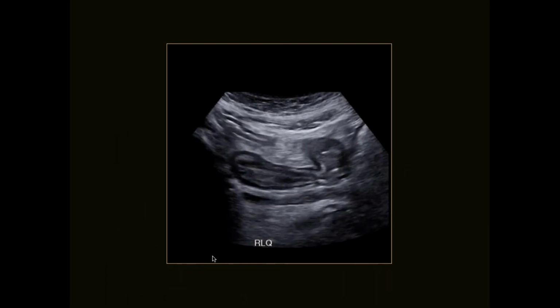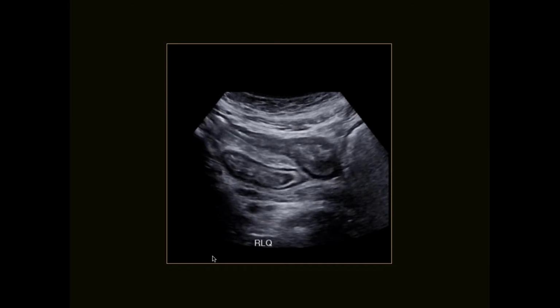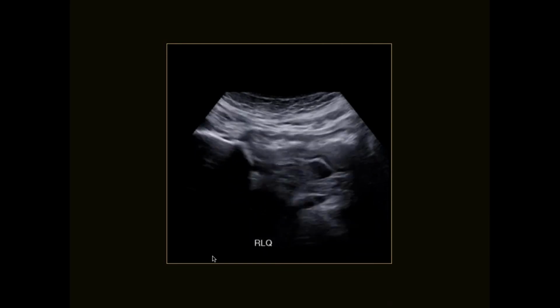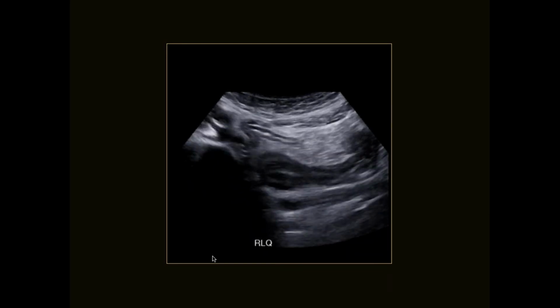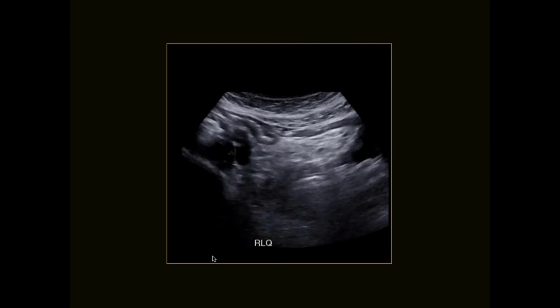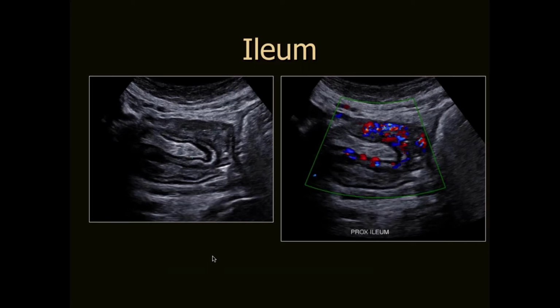So when we're looking, we can see immediately, just looking in her right lower quadrant, that there's a loop of abnormal bowel there with quite marked thickening of the wall and a fixed acute angulation as the bowel goes deep into the pelvis. Now, we're concentrating here doing our focused assessment. We can see this loop of bowel quite well, and we can see this fixed acute angle. We can see a profuse vascularity on color Doppler imaging, and perhaps we're a little suspicious that there may be something going on in this angle.